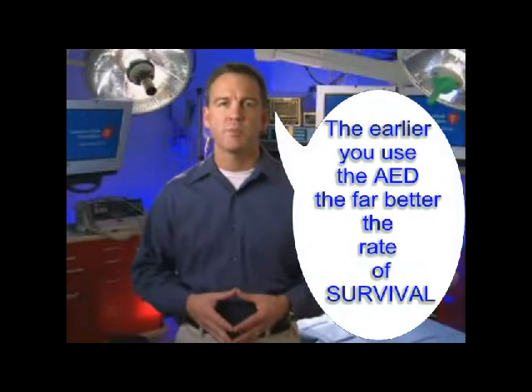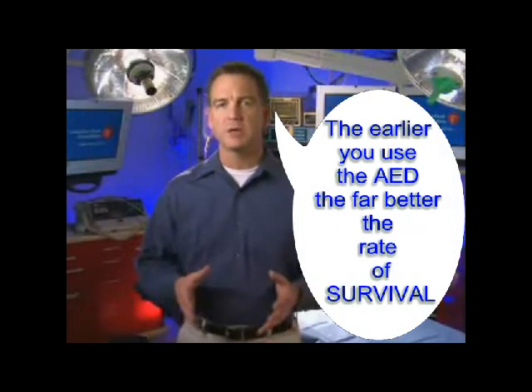If the victim doesn't respond, activate the emergency response system if you are not EMS and get an AED. If you are in an out-of-hospital setting, you'll call either 911 or your local emergency response number. If you are in an in-hospital setting, you may generally call a code and get a crash card.